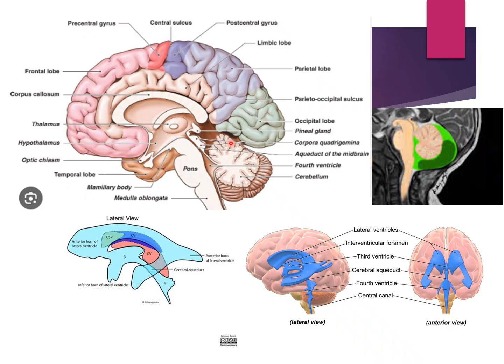Then we have our ventricles. And we're going to kind of need to know a lot of these ventricles. So just going through them, we have the anterior horn of the lateral ventricle, the posterior horn of the lateral ventricle. We have the third ventricle, the fourth ventricle, and then we have the cisterna magna, and this one really highlights it a lot better. So the cisterna magna, if you have your cerebellum right here, it's going to hang out in that posterior aspect of it, and we do need to check this.